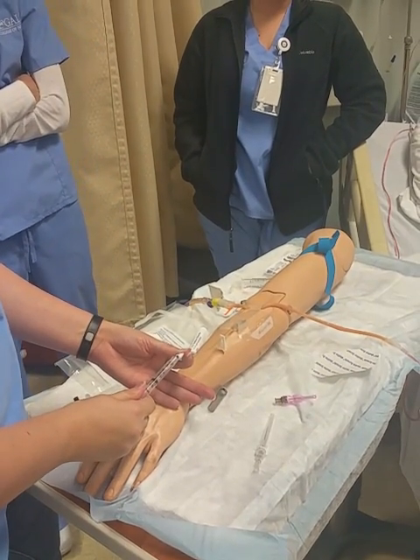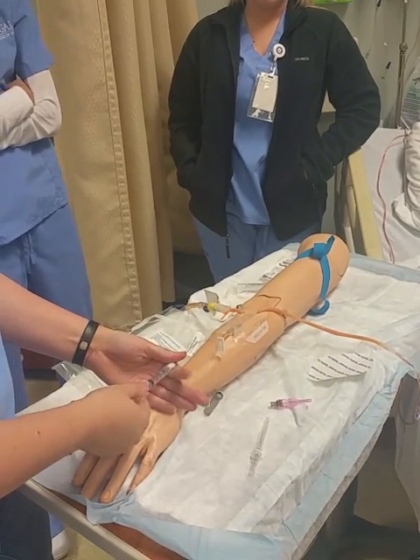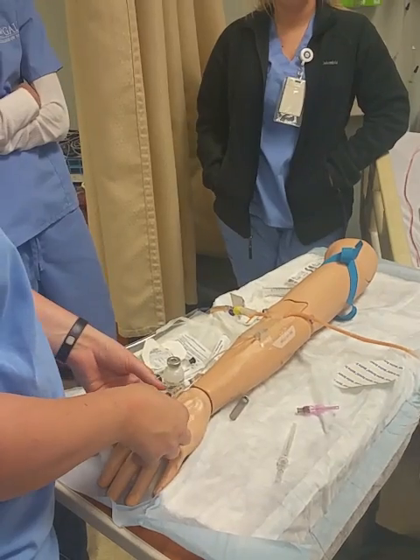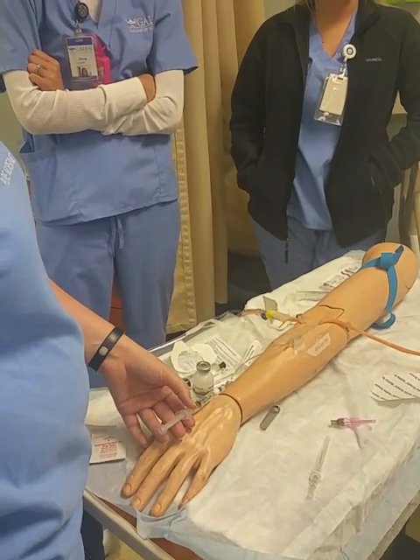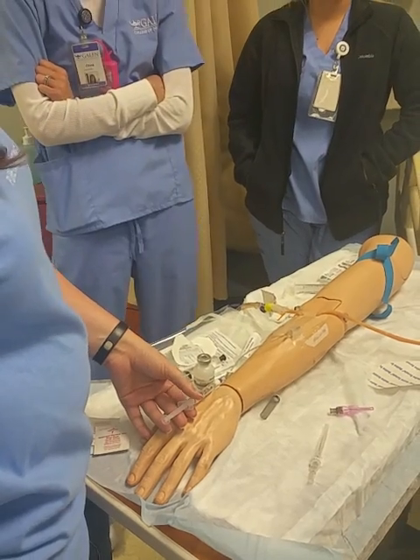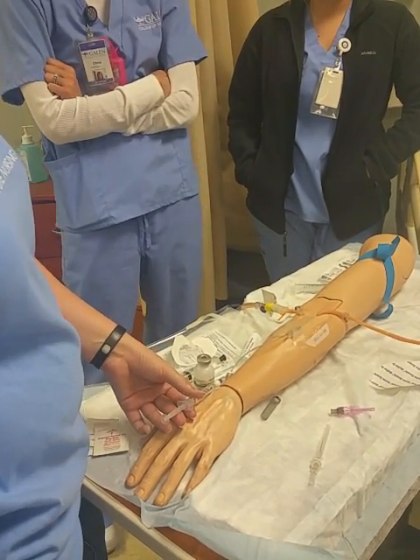Okay. Now, here's where I need those administration instructions. I know I have 40 milligrams, which is 2 mLs. My order says no more than 20 milligrams every minute. How many minutes do I need? 2 milliliters, 2 minutes. 1 milliliter, 1 minute. Half a milliliter, half a minute. Quarter of a milliliter, quarter of a minute.